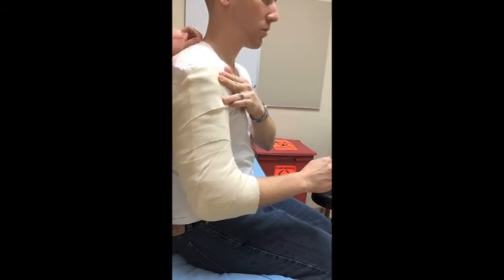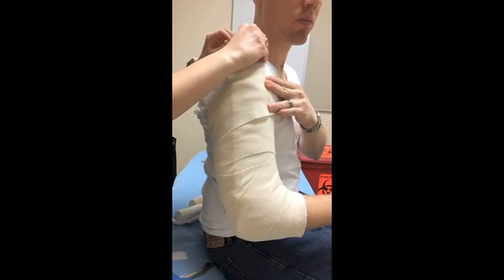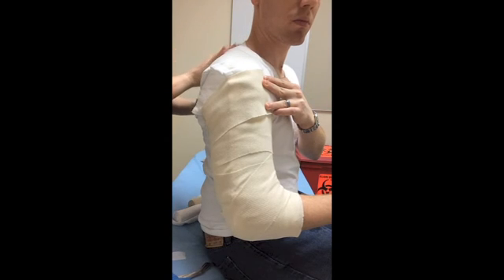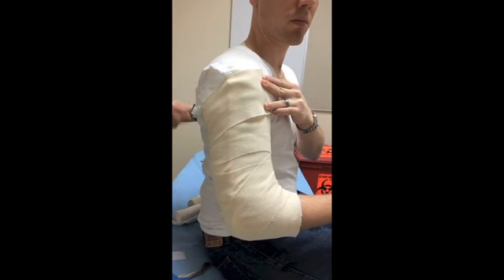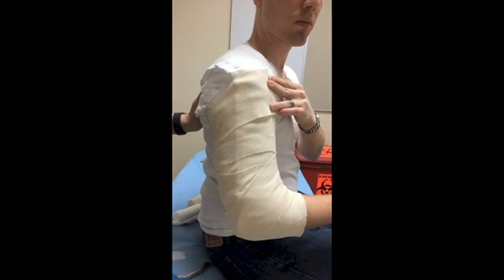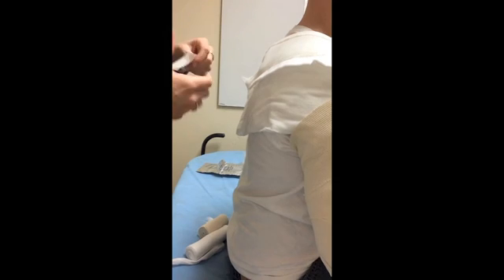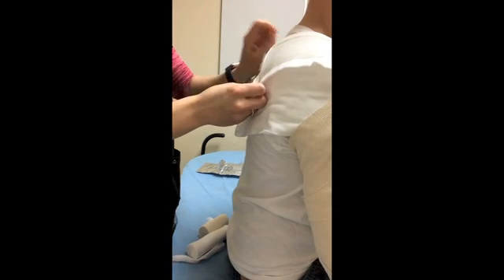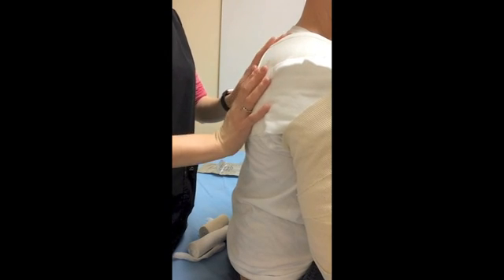Once we see where our splint has ended, we can go ahead and roll back a little bit of that excess web roll so it's not rubbing against the neck. And then fold up as needed in the back. This is where we may secure with just a little bit of tape, just the splinting material to the web roll so that it doesn't go anywhere, but we don't need to tape to the patient's skin.